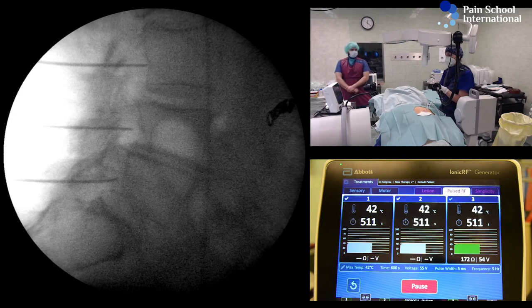If you have a sharp needle, you can compromise the exiting nerve root and leave the patient with permanent pain.